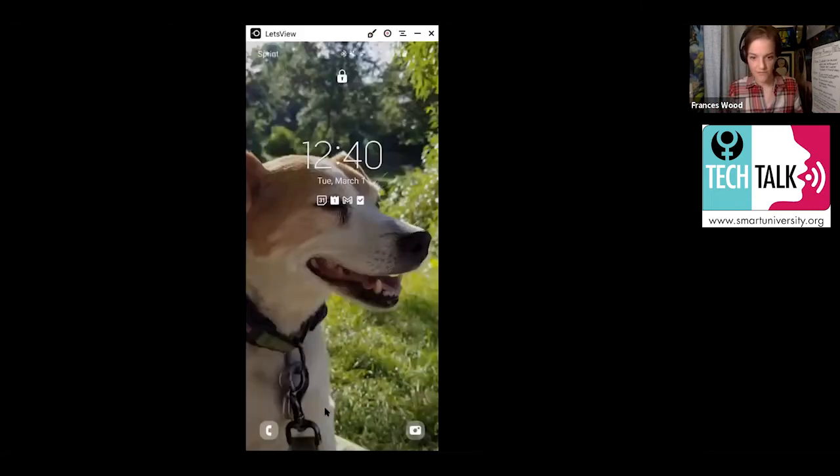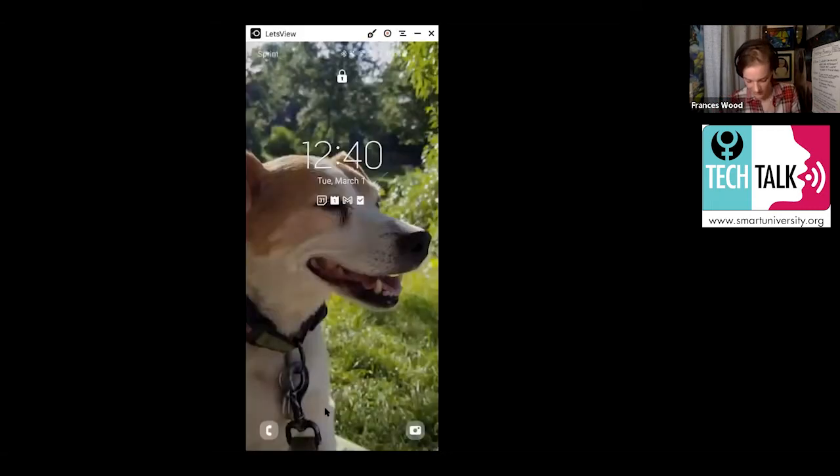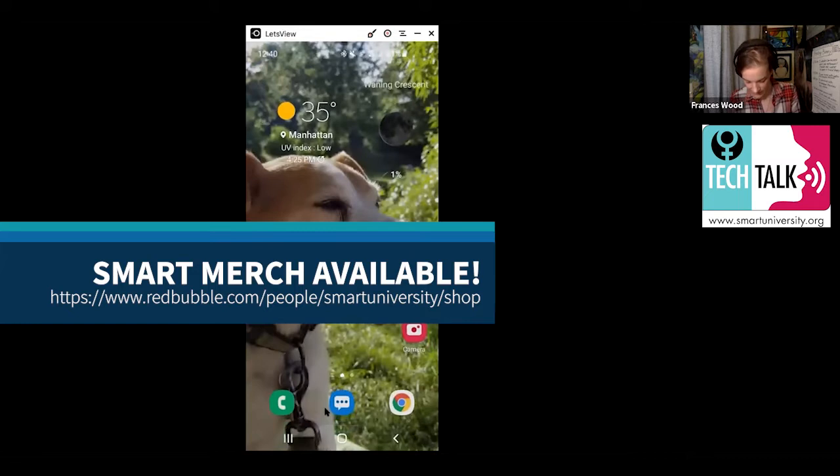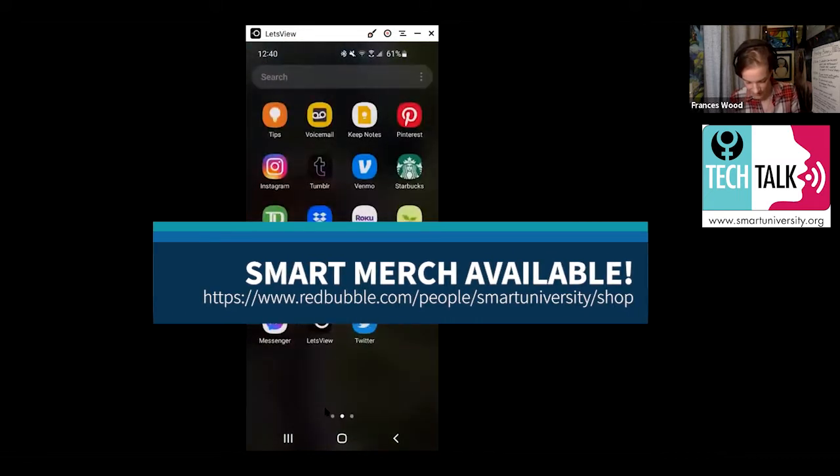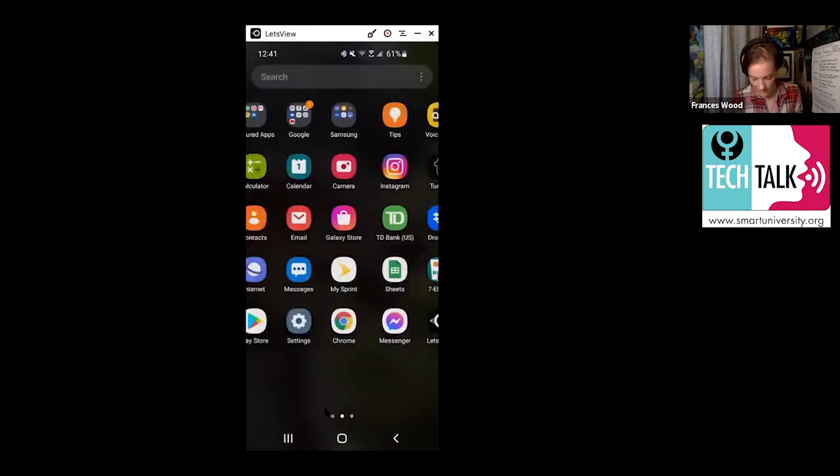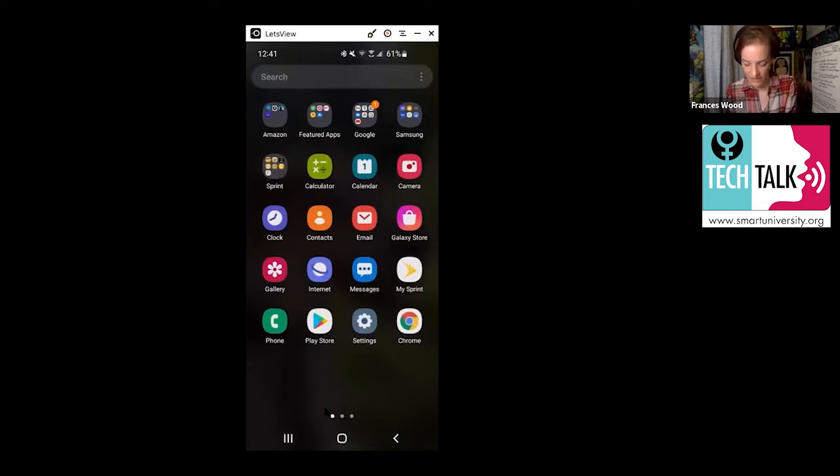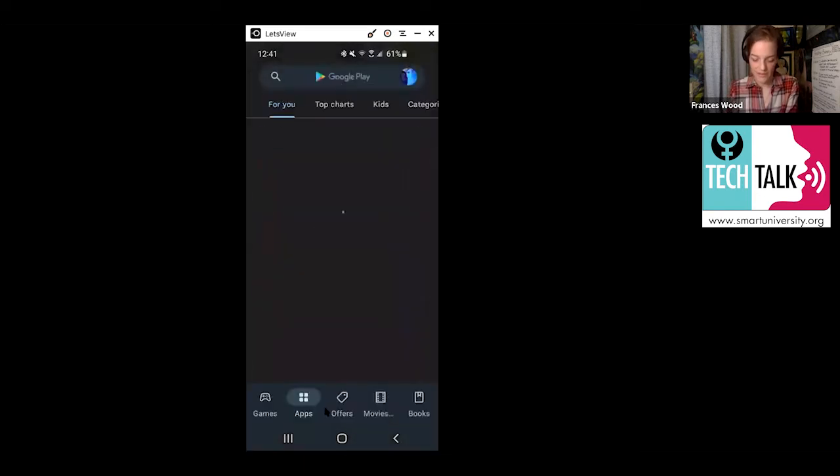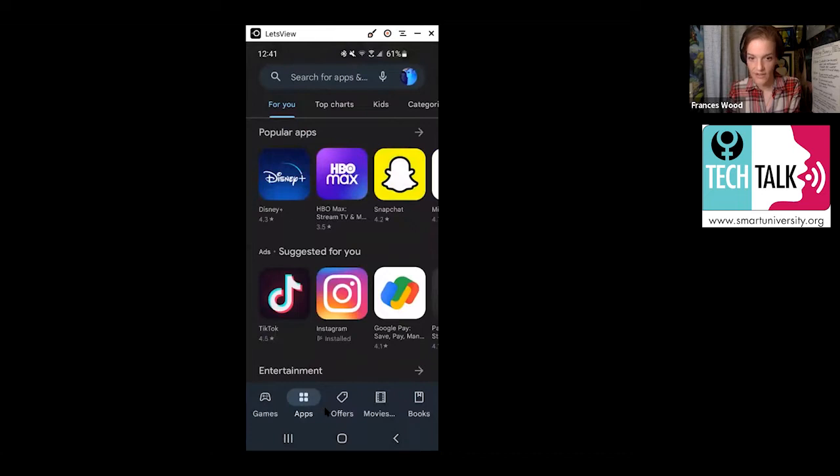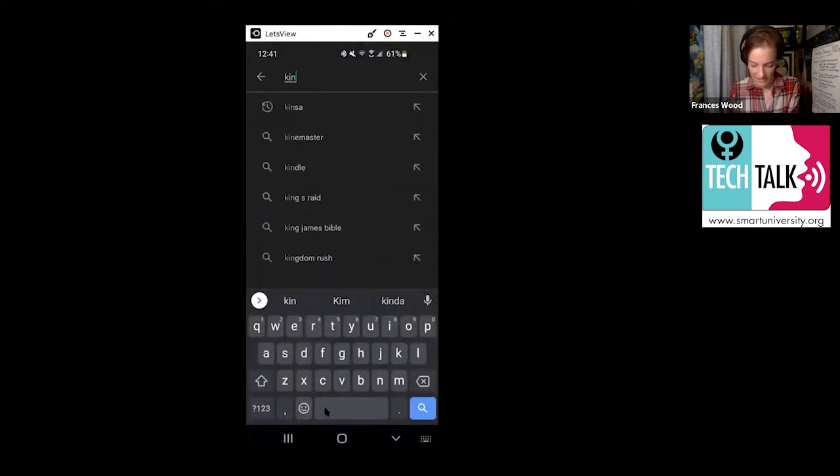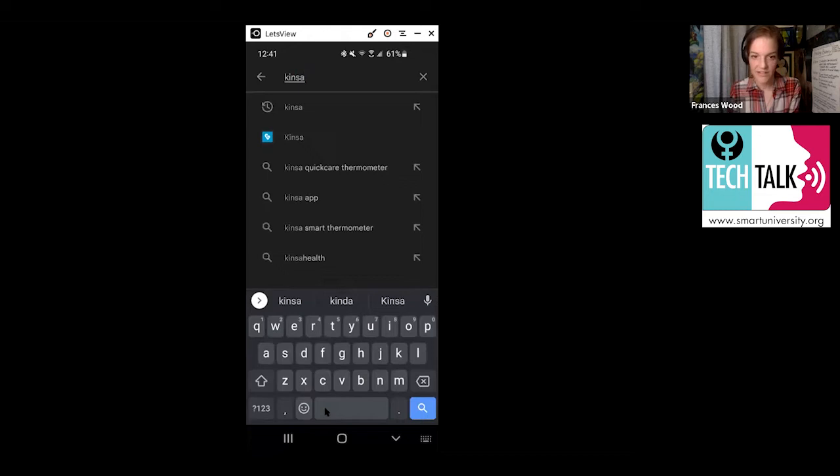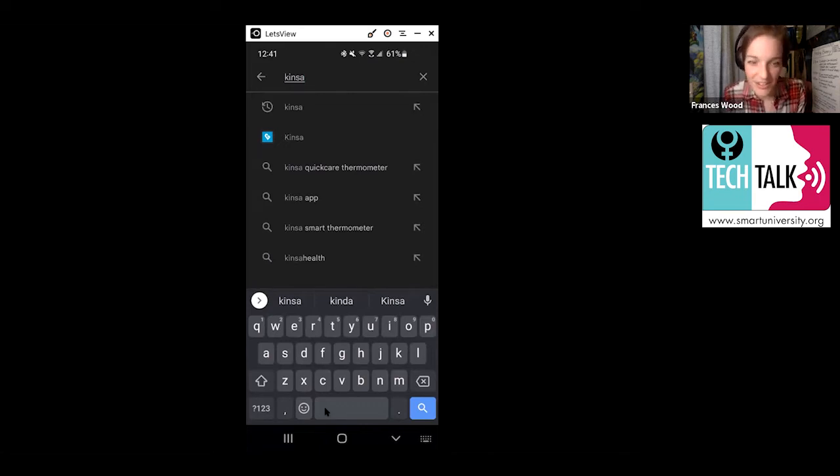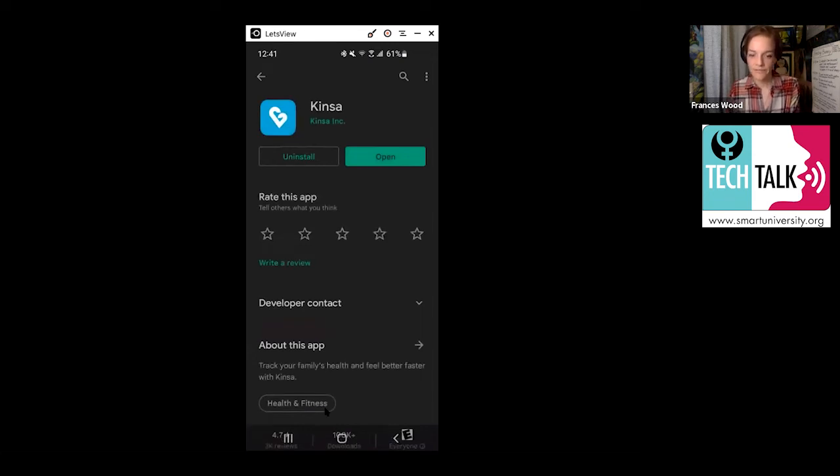The first thing we're going to do is download the app. We're going to go to the App Store, or if you have an Android phone, you're going to go to the Play Store. What you want to look up is Kinsa, spelled K-I-N-S-A. And the app you're looking for is this one right here that looks kind of like it's blue and kind of looks like a little heart. You're going to click on that.